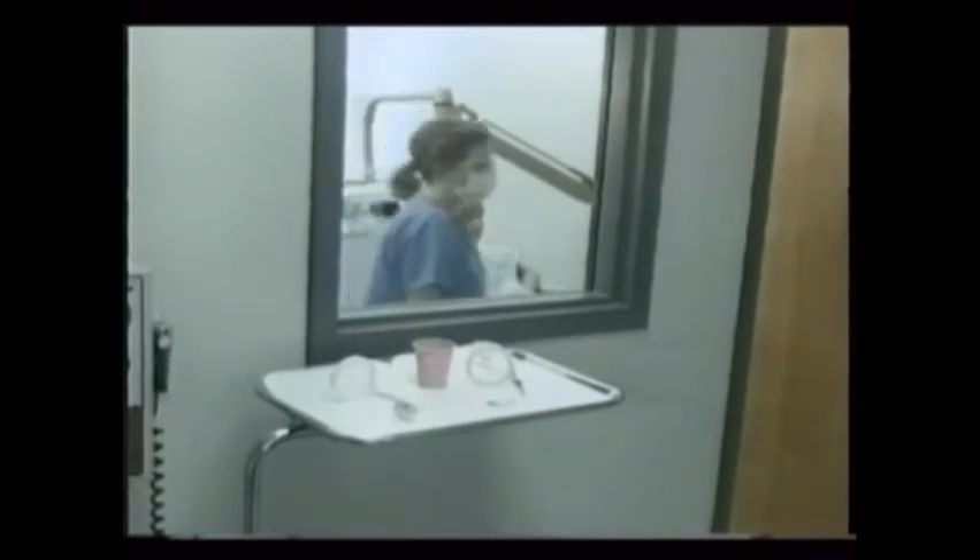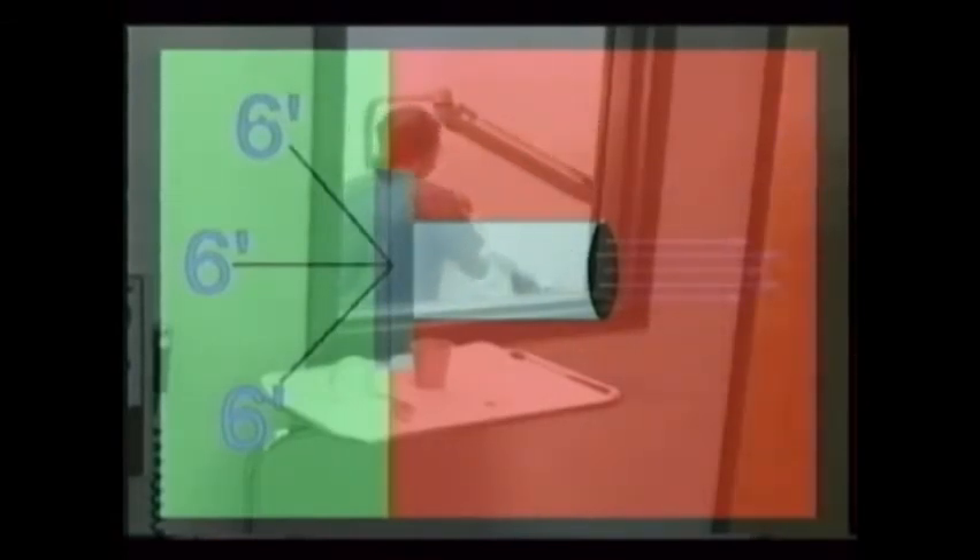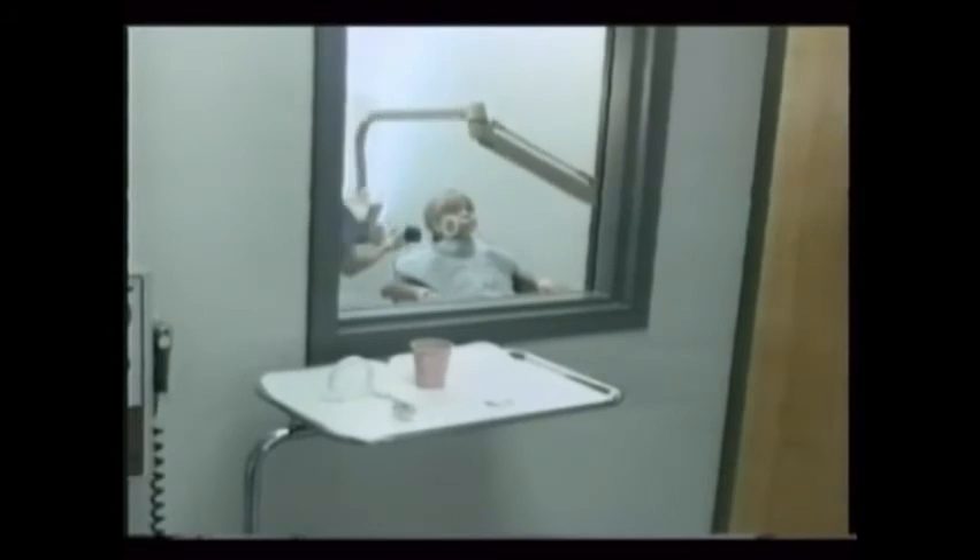When exposing the film to the x-ray, for your protection, remember to get behind the primary x-ray beam and at least six feet from the tube head. Ask anyone else in the room that may be in the line of the x-ray beam to leave — except for the patient, of course — and if they can't, they must wear a lead apron.